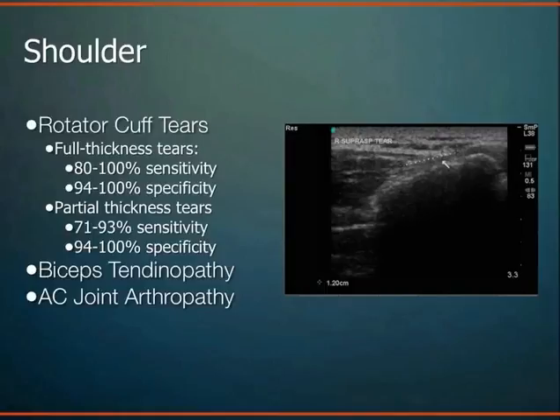So around the shoulder, this is an area that has been studied a lot because this is one area that is very common diagnosis and clinical complaint. Shoulder pain, shoulder impingement, rotator cuff tendonitis, a big reason why patients come into the clinic, and a big reason why we order a lot of MRIs. And so people are trying to find out, can we use ultrasound in the office, avoid MRIs, avoid healthcare costs, and is it a reliable modality to diagnose these rotator cuff tears or rotator cuff tendinopathies? And what we're finding with the literature is that it is very accurate and very reliable, and with sensitivity and specificity numbers that are quite remarkable in some cases, very reliable modality.